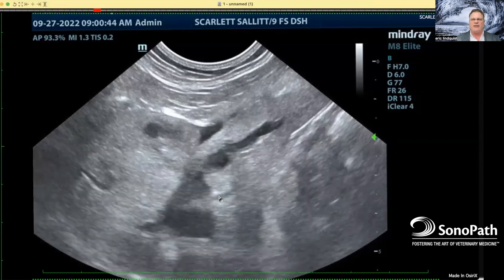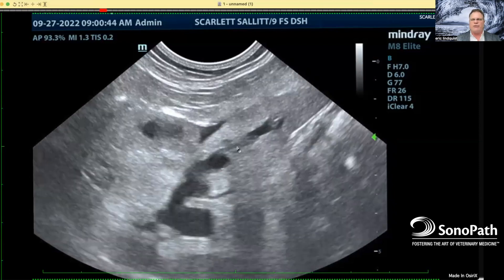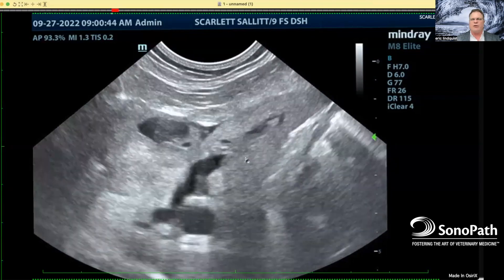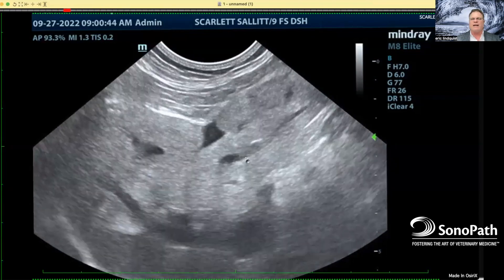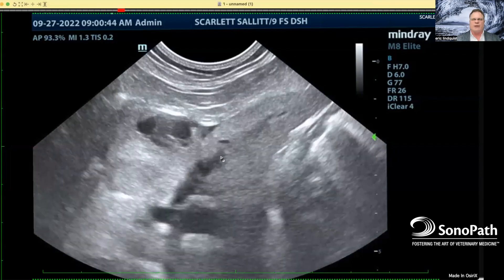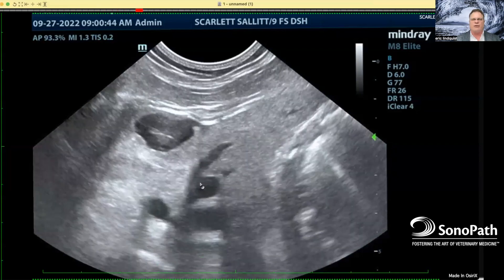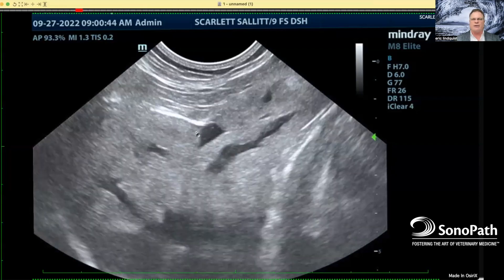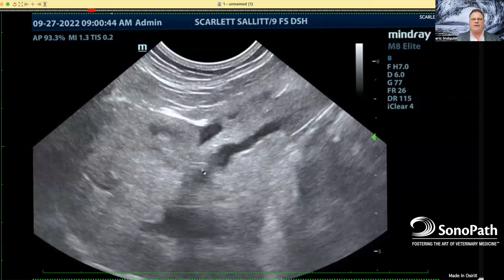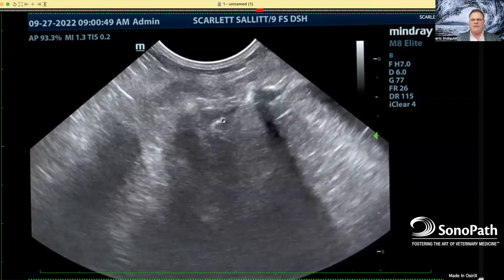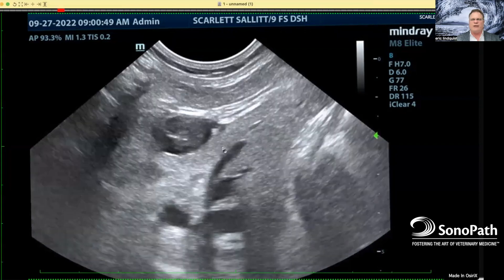That's probably not going to be anything good, and then you have all these extra tubes going on. What are these? Well, if you put color flow over these, it'd be color flow negative. These are the intrahepatic biliary ducts that are dilated, and it's hallmark of post-hepatic obstruction. So when you have nodular hepatic changes and post-hepatic obstruction and free fluid as well, there's a lot of badness going on here.